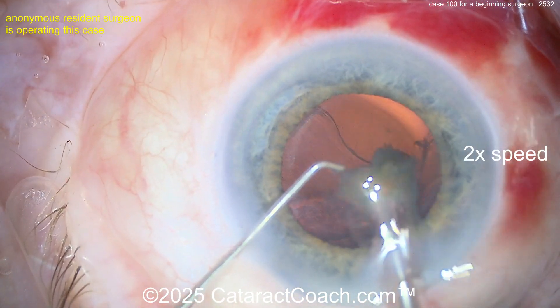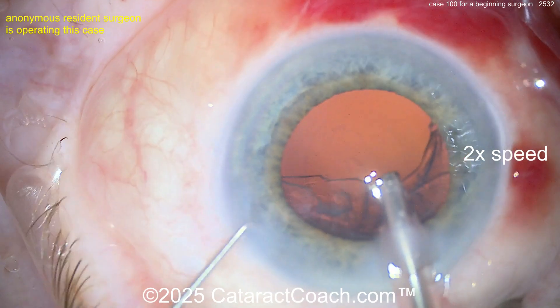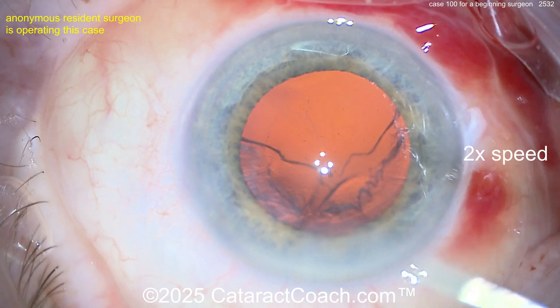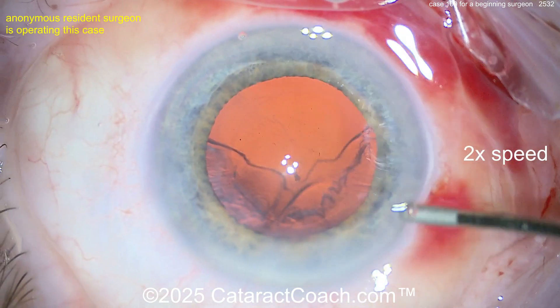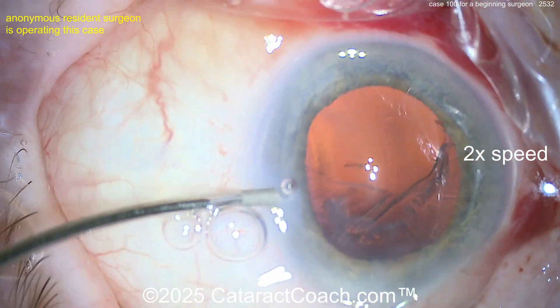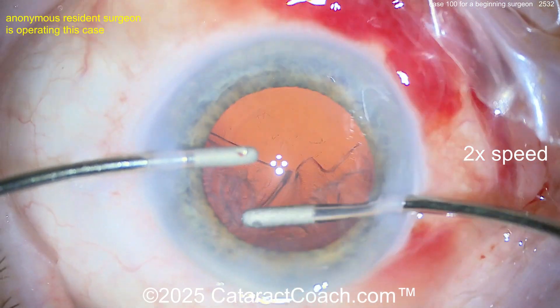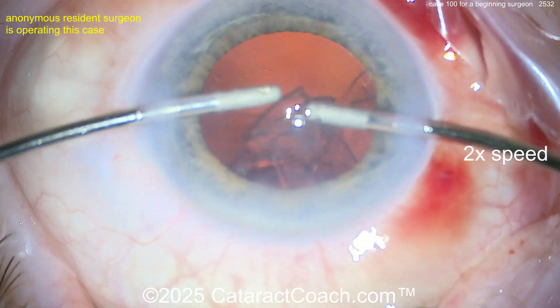But look at the anterior chamber instability — look at the bounce. See the iris bouncing and the capsule bouncing? That's fluidic imbalance. You need to check your phaco settings — don't just copy some senior doctor's settings, figure out your own. In a case like this with too much chamber bounce, you need more infusion pressure: more fluid going in, less coming out. Drop your aspiration flow rate — if you're doing 40 cc/min, drop it to around 32 cc/min — and increase your infusion pressure to get better chamber stability.